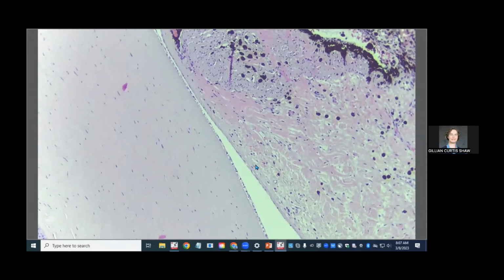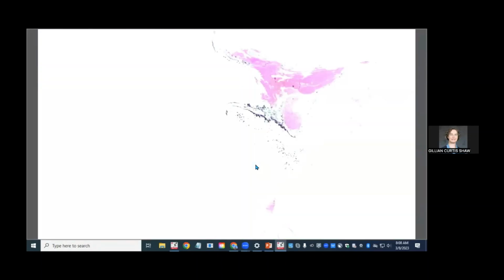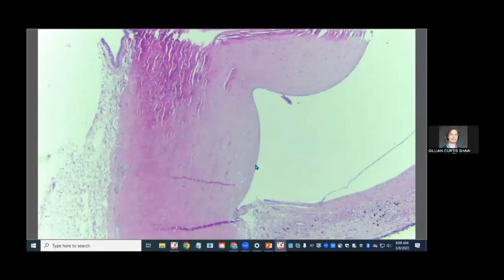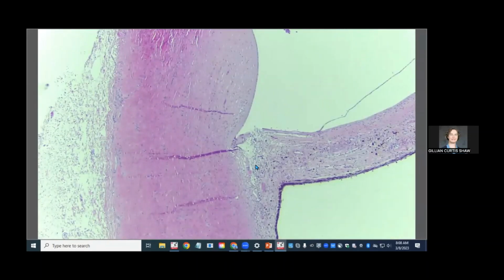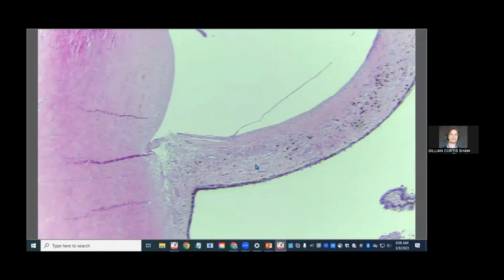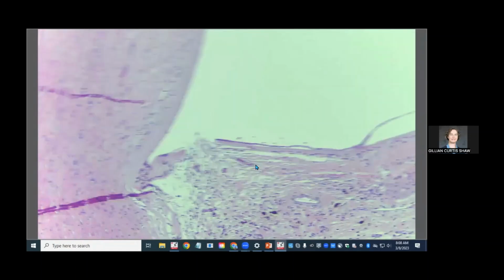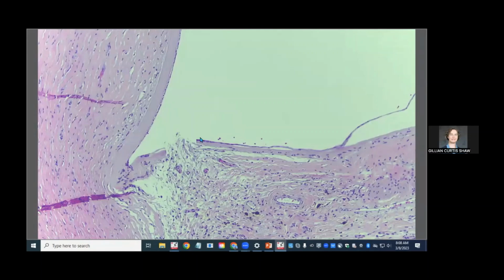So we have the corneal endothelium and Descemet's membrane continuing right over the iridocorneal angle, which is no doubt occluding and preventing aqueous humor outflow, which will definitely be contributing to glaucoma. I can't remember if that was present on the rest of the stuff up here. Let's take a quick peek. This one looks slightly more normal. We have at least some identifiable ciliary cleft and trabecular meshwork. But yeah, actually Descemet's does continue right over it. You can see it right here. So it's a pretty consistent change.